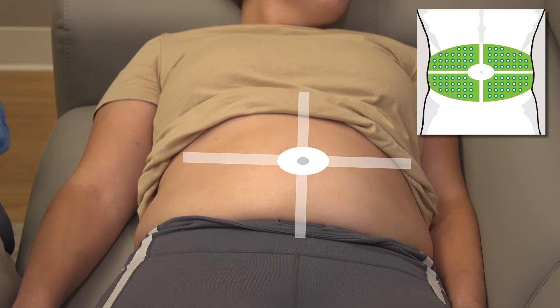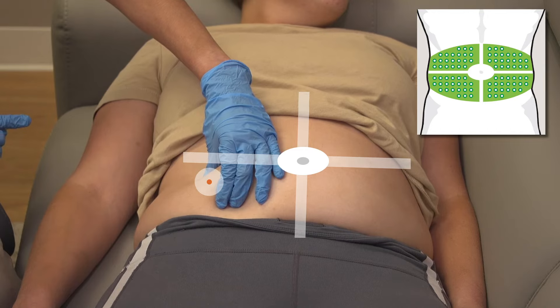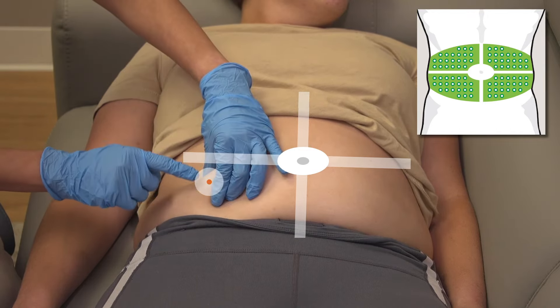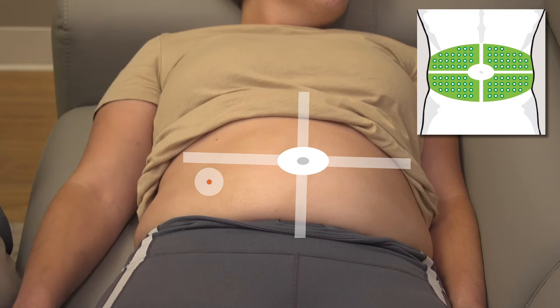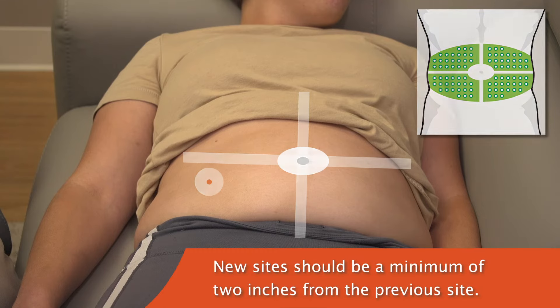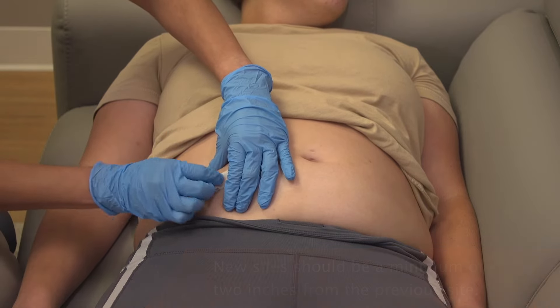Avoid the umbilicus area. Choose an injection site in one of the four areas outside of the umbilicus, which should be a minimum of 2 inches from the umbilicus. Make sure that the site has enough subcutaneous tissue to accommodate the needle and injection. Use a different injection site each time the medication is administered, and the new injection site should be a minimum of 2 inches away from the previous site.